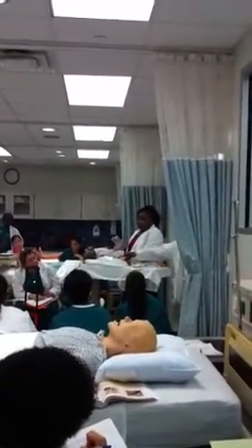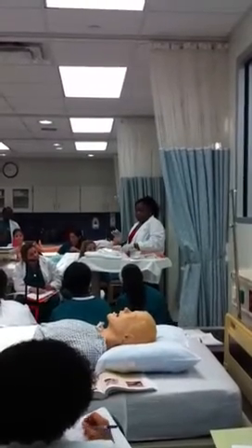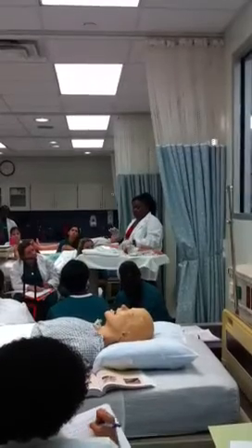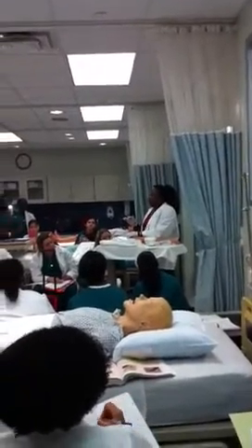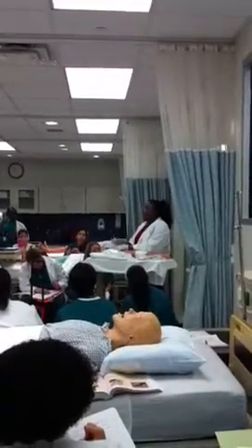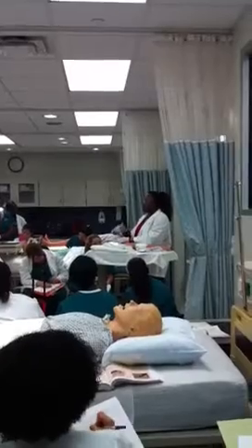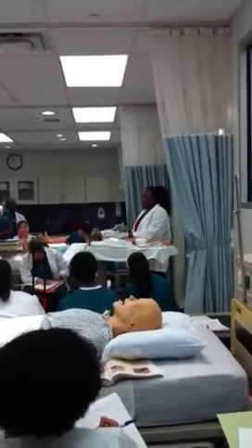Now, when we give sub-Q, all right. I usually just put it back in there and put it up here. When you use sub-Q, all right, when you wipe with alcohol, let it dry, please. Because if you punch a hole in that wet alcohol, you instill that alcohol in them. So let it dry. All right?